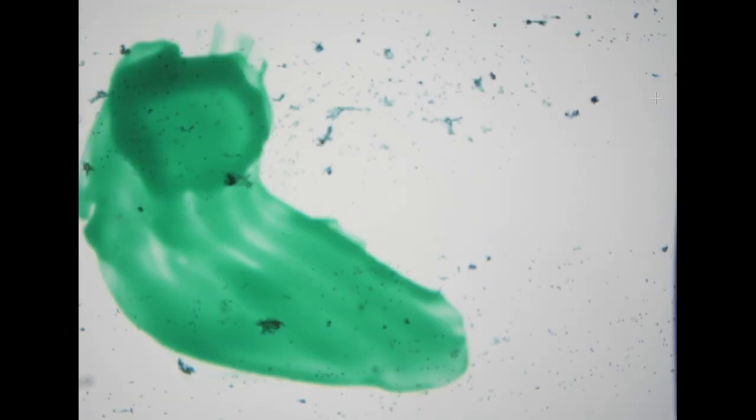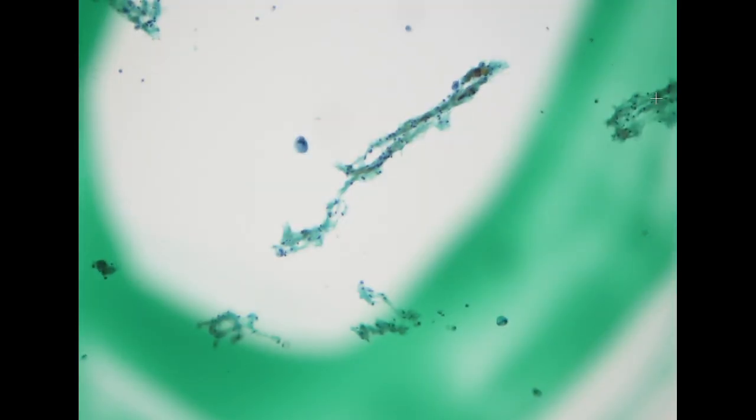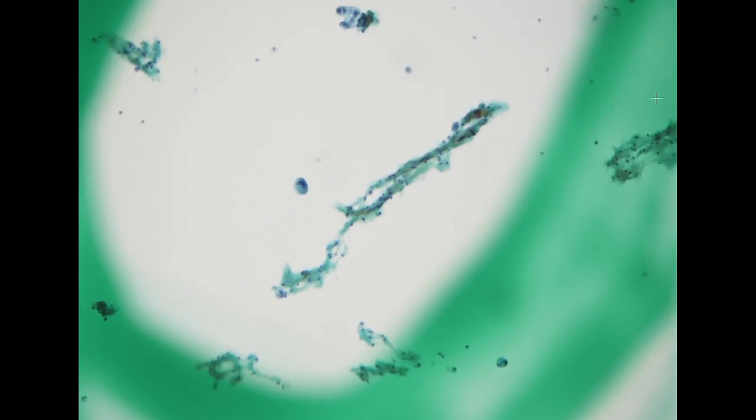Sometimes in this recurrent setting, the cancer cells can be really, really scant, so it would sometimes be very difficult for you to confirm that there is metastatic cancer. Multiple different preparations sometimes can help you to tell. So for that case, in the cytospin, I think we can call it at least atypical, but for the cell block preparation, I think we can be very confident that they are adenocarcinoma.